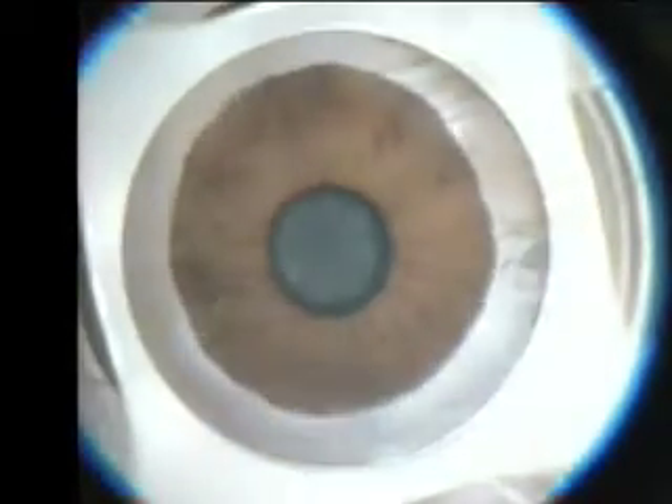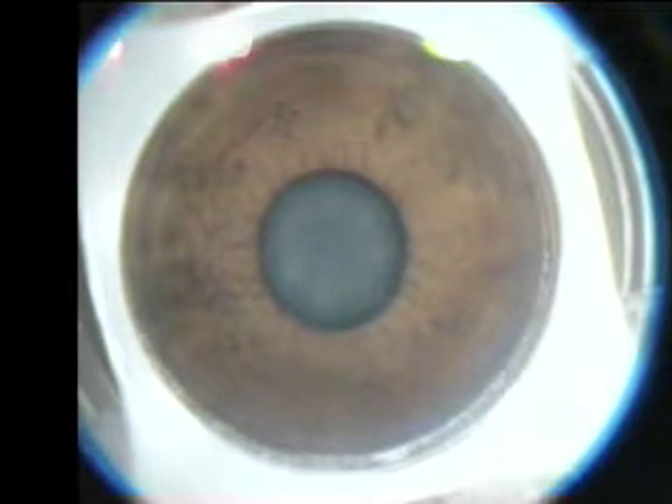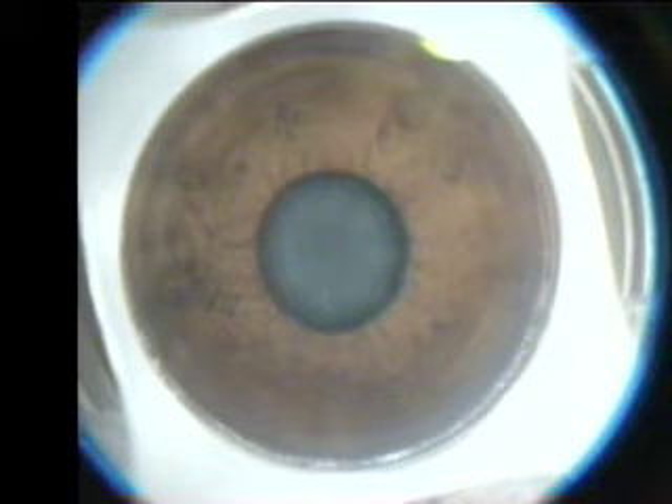We're going to go straight into seeing the left eye. The left eye — we're going to use the same LASIK technique, but a different ablation pattern. The applanation of the left cornea seen here. With the IntraLase we are going to create a large 9.5mm flap here as well. The difference in this patient will be the ablation profile, which will be a standard hyperopic correction centered on the pupillary center. We're seeing here the IntraLase ablation pattern. This flap is centered to the pupil of the patient.